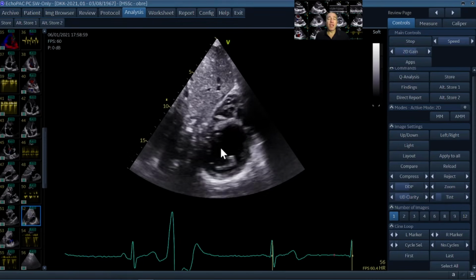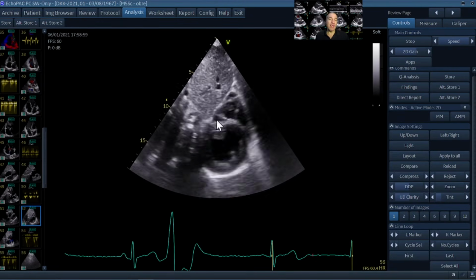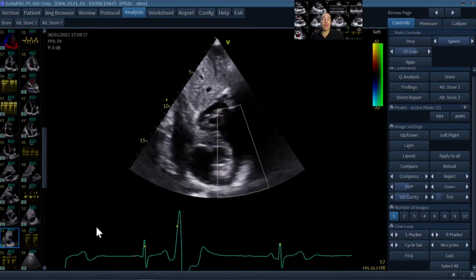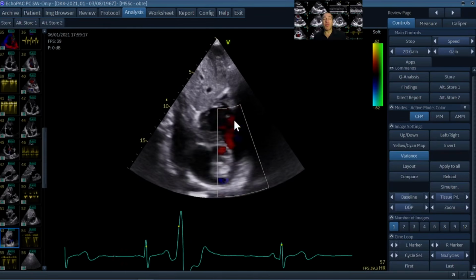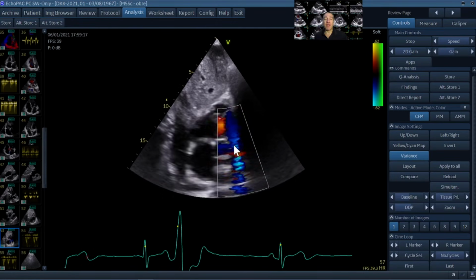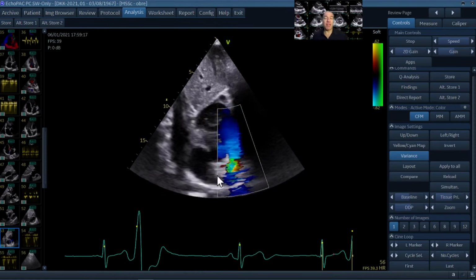seen here. Of course, you have to then rearrange the segments of the left ventricle in your mind. And if you then tilt more to the cranial direction, you might get an ideal view on the right ventricular outflow tract, ideal for Doppler and for judgment whether there is significant pathology.